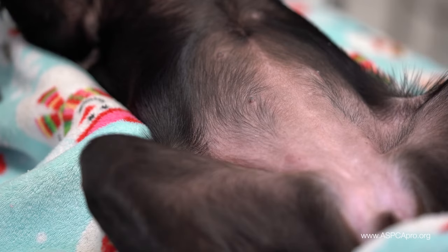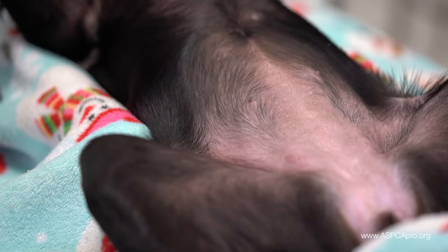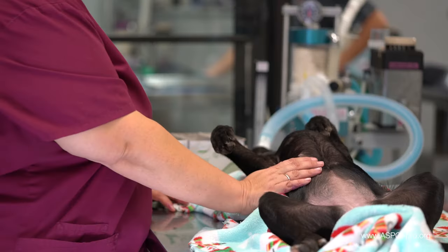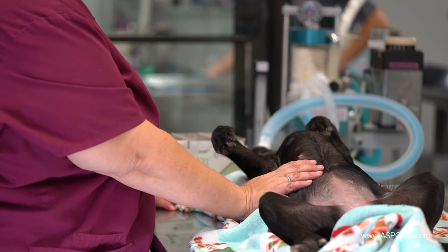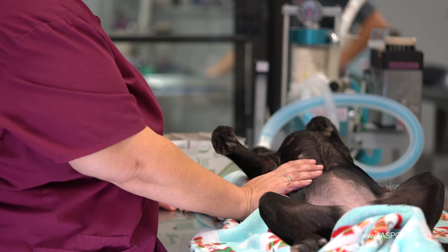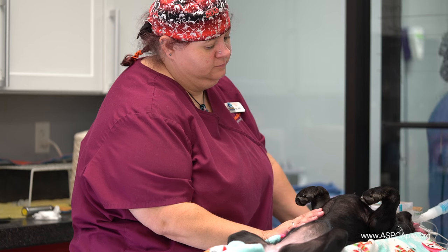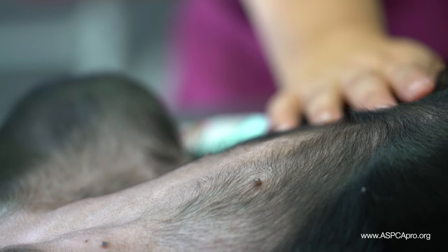Ideally, a patient's respiration rate should be around 10 to 20 breaths per minute when at a surgical plane of anesthesia, but the quality and character of the respiration is just as important to monitor. A slower rate may indicate that a patient is too deep, and a higher rate may indicate that a patient is too light.